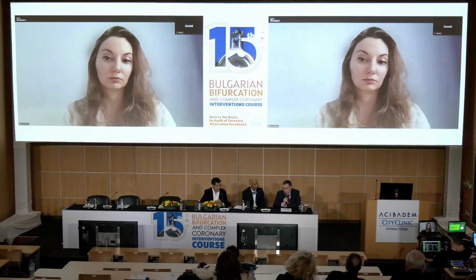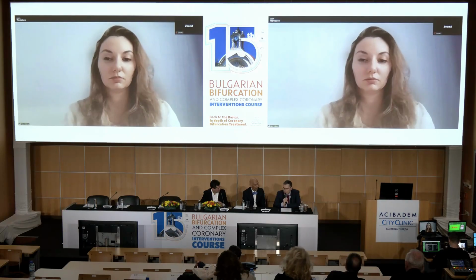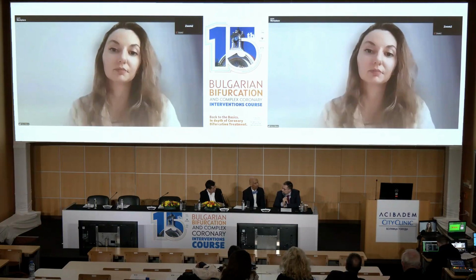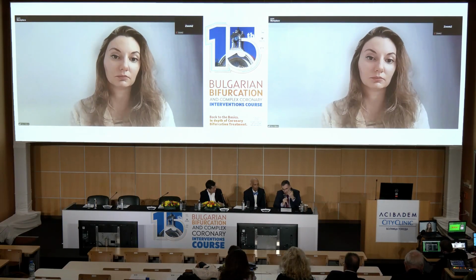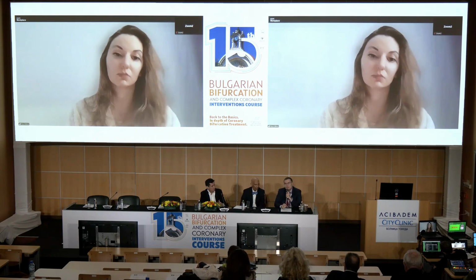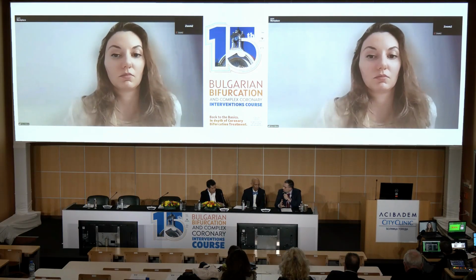To be honest, at the moment, I'm keen on all unsuccessful cases to directly do a CT, just to be sure that on the next attempt, I will have a complete anatomical image of the vessel. This is because we have an opportunity to do that, because Nia is working together with me. But this is difficult to give a recommendation, because it depends on the center's capabilities.